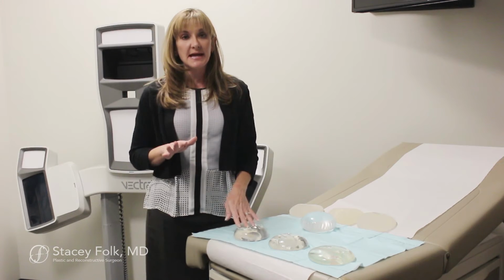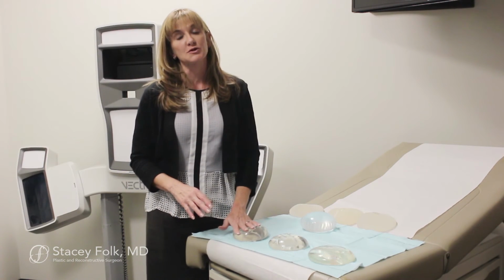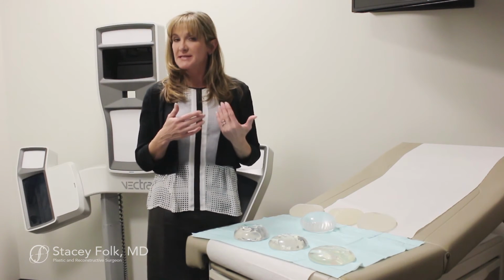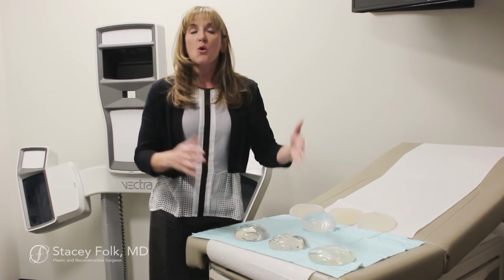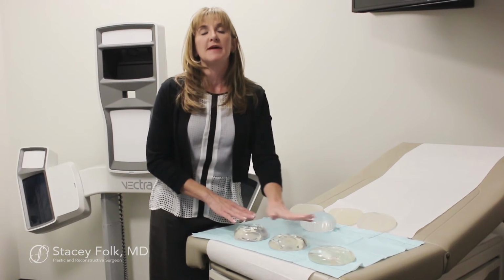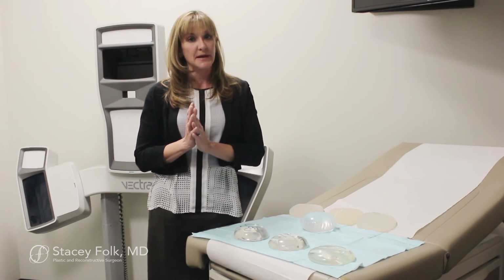So the big mistake is coming into this process knowing what profile you want first, because if you have that idea in your head, you're probably going to potentially go down a wrong path. So be open to various implants. Once we find the volume that you like, we will help to give you advice on which profile is best suited for your individual anatomy.